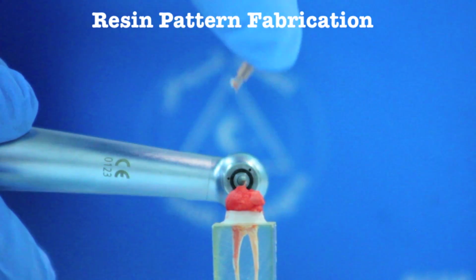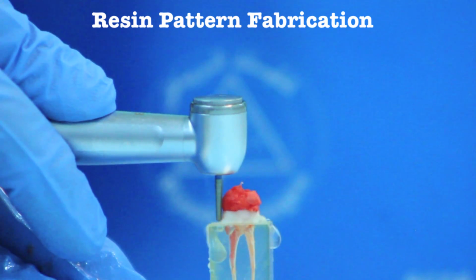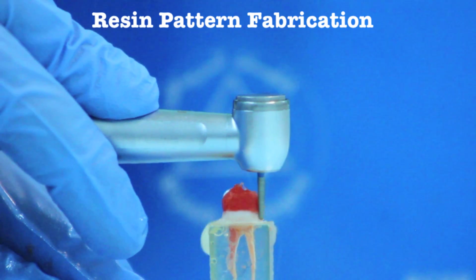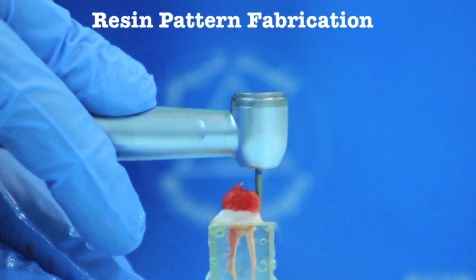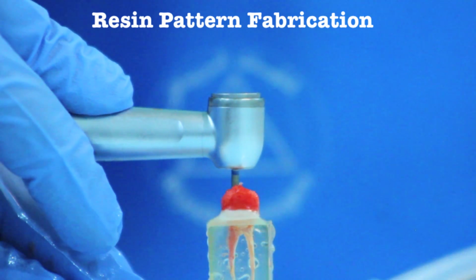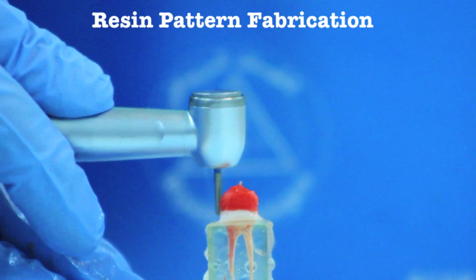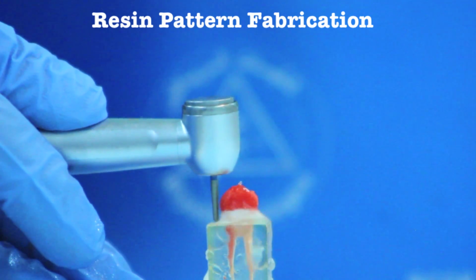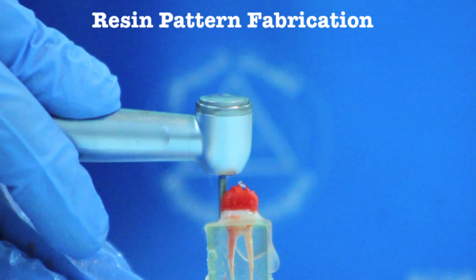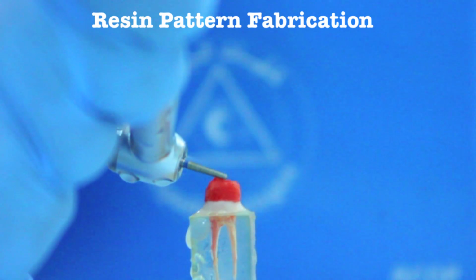Cut the excess of the post and shape the core with the large round end tapered diamond. Use water spray to prevent overheating of the resin. Apply all the principles of tooth preparation, axial reduction, and occlusal reduction. There should be no roughness or undercuts.